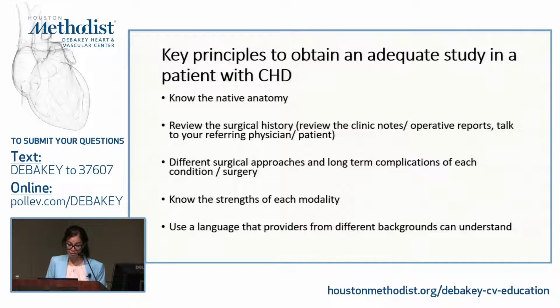Congenital heart disease requires a multimodality approach, always. You need to keep in mind the strength of each modality, and all of them are complementary. When we are in the MRI lab, I always tell the fellows that this is not discovery MRI. We should look at the CT, at the echo. The more we know, the better our study is going to be.